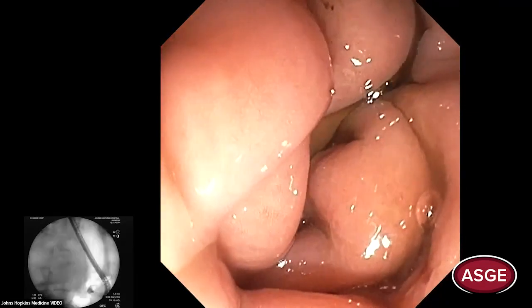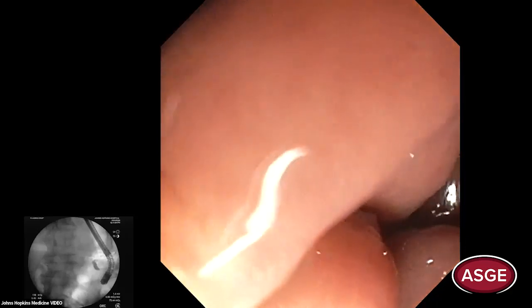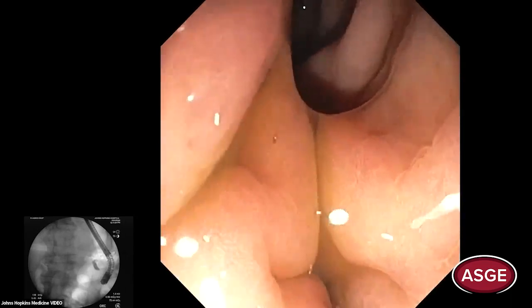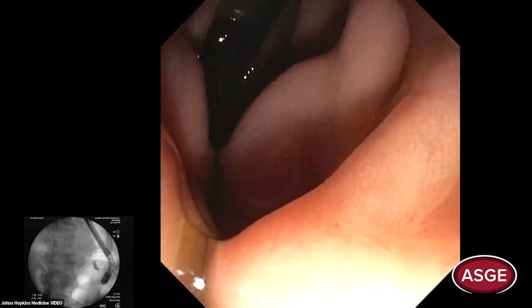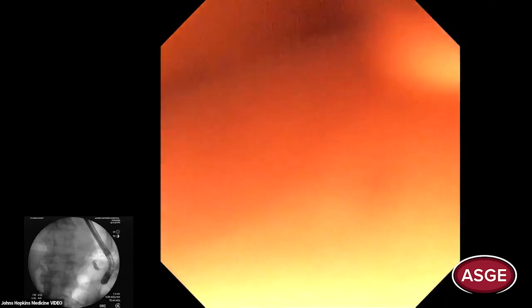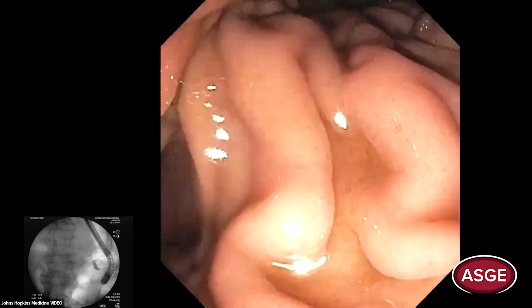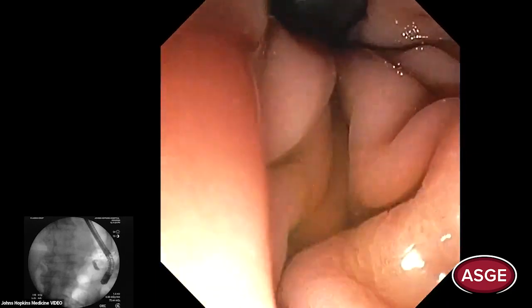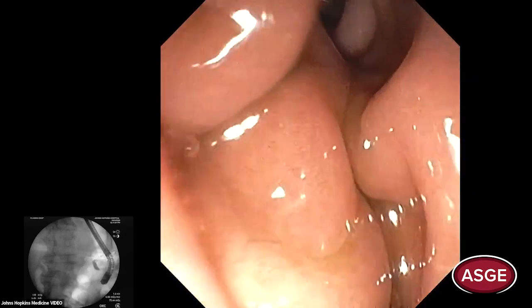Suggestion to put the patient in left lateral decubitus — that's the next step. This patient has Roux-en-Y gastric bypass and is barely fitting on the table, making it very hard to maneuver. If we can change position we will, and usually left lateral is the trick. Maybe from the beginning, for the fluoroscopy part, starting patients in the left lateral could make interpretation of images easier.